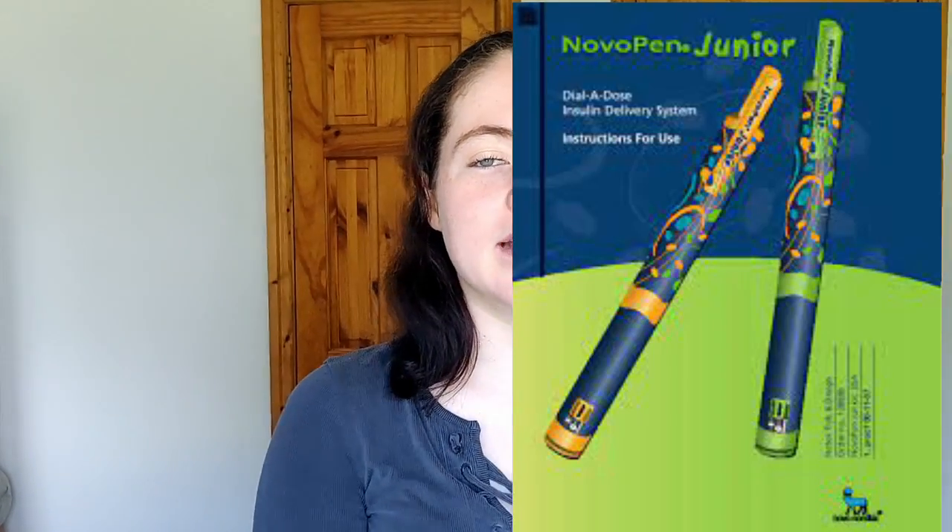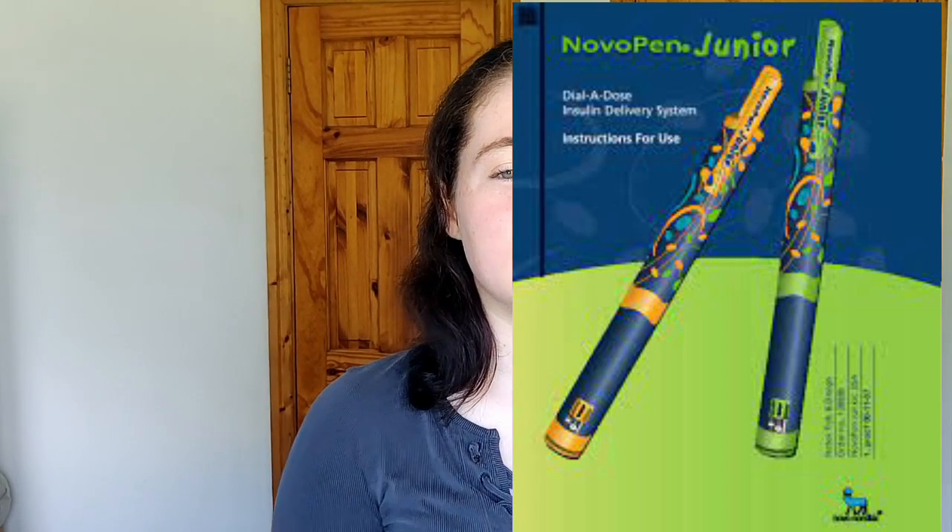In between Novo pen 3 and Novo pen 4, there was the Novo pen 3 Demi I just showed you, but there was also a new pediatric insulin pen called the Novo pen Junior. I never had this one, but it had childlike designs on it — like spaceships and rockets — in nice colors designed toward children. It did half doses as well. The Novo pen 3 was released in 1992, the Novo pen 3 Demi in 1999, and the Junior came out in 2003.